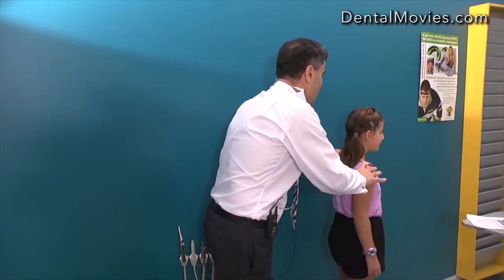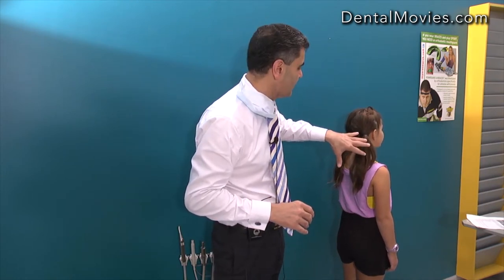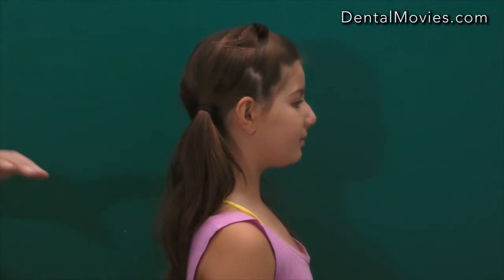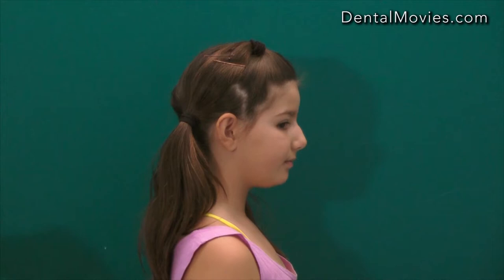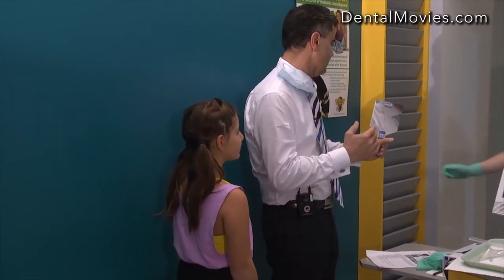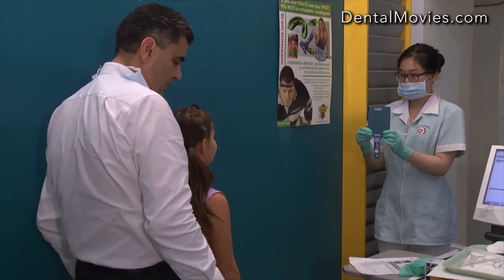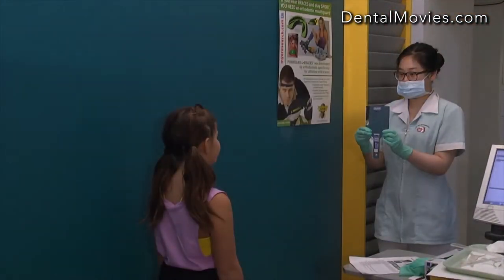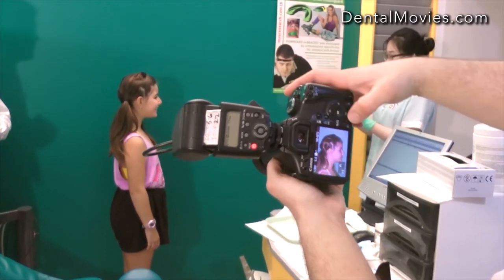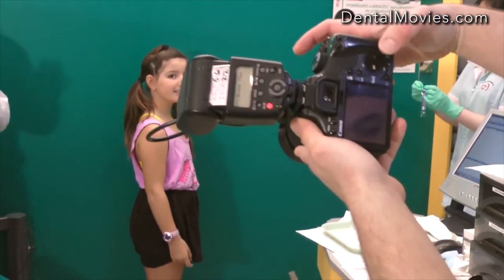The patient now turns 90 degrees to look straight ahead. In this photo, it's very important that the hair is off the face. Many times I see photographs with glasses on or hair over the face — we need to see the mandibular plane angle. To achieve natural head posture, the ideal approach is for the child to look at their own eyes in the mirror. We then take the two 90-degree extra-oral photos — with and without smile. That completes our six extra-oral photographs.